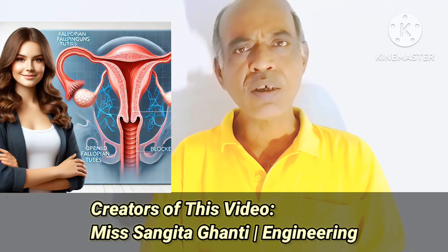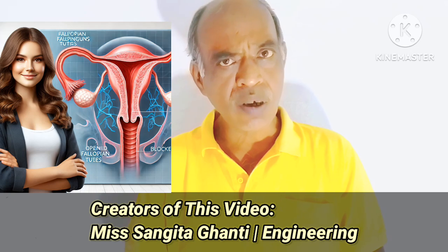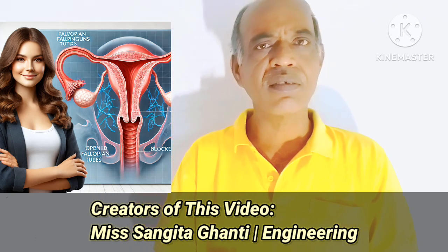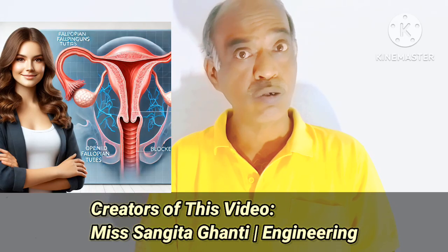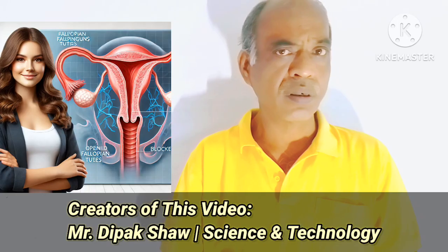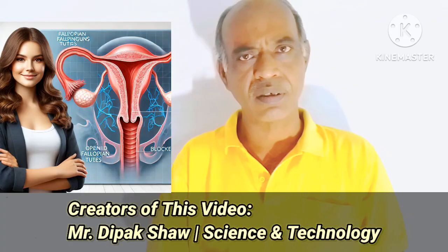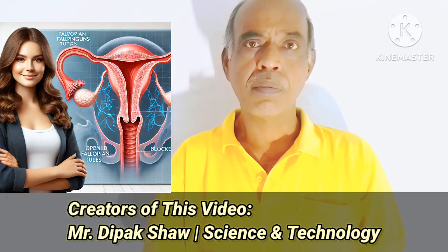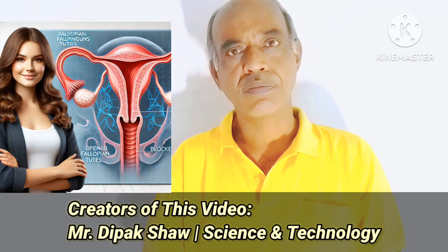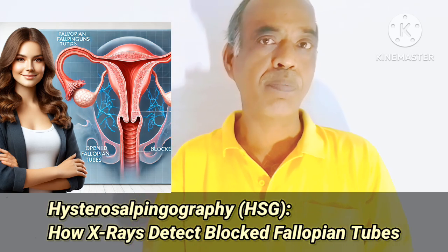But maybe one tube is blocked and the other one is open. In that case, there is a chance of pregnancy, but the chances are reduced. And if both are blocked, in that case there is no chance of natural pregnancy. And say, for example, the tubes are blocked but only partially. If a partial blockage is there, what happens?